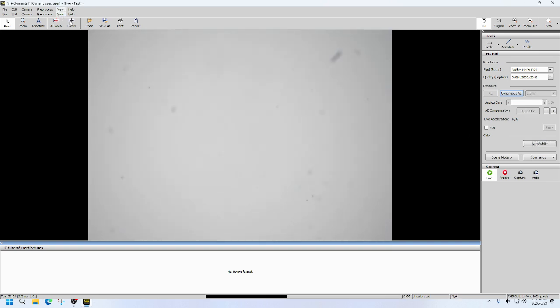So the cellularity of this specimen is quite low. Basically, this is very common in the voided urine specimen because not every urine will have a lot of cells, because the majority of the cells were exfoliated. So sometimes they would have a lot, and sometimes it's just a little bit. In this specimen, we have very few cells, but some of the cells do show cytologic atypia.